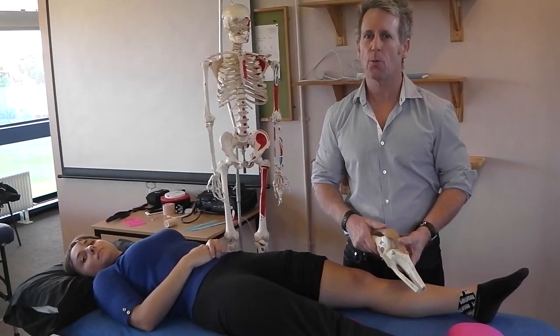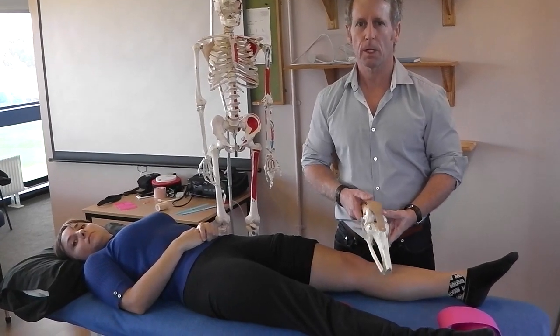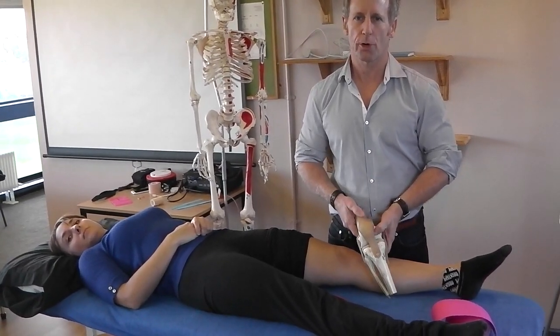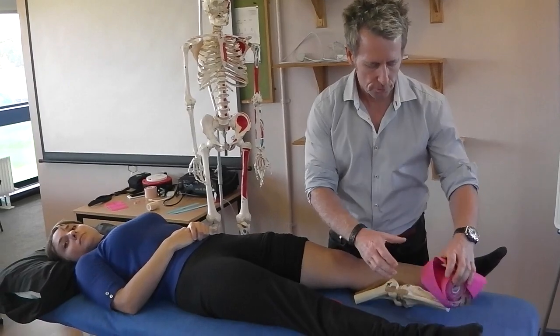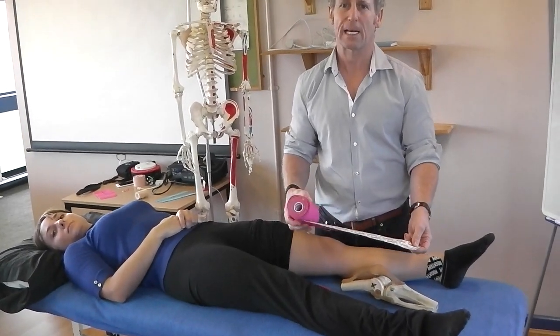My name is John Gibbons and today we are going to look at taping for patellar femoral pain syndrome — almost like a modified McConnell technique, but we're going to use the 10 centimeter rock tape, also known as the Big Daddy tape.